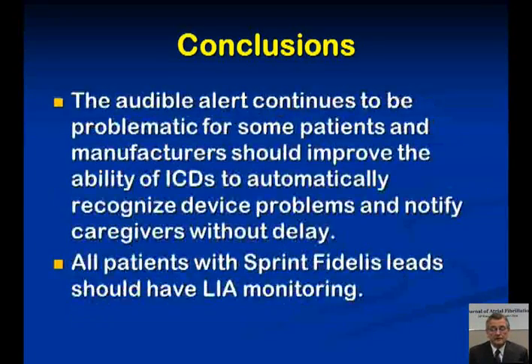The audible alert continues to be problematic for many patients, and manufacturers should improve the ability of defibrillators to automatically recognize device problems and notify caregivers without delay. Finally, and probably most important, all patients who have Sprint Fidelis leads should have monitoring by the lead integrity alert algorithm.